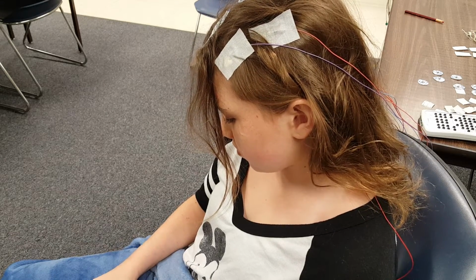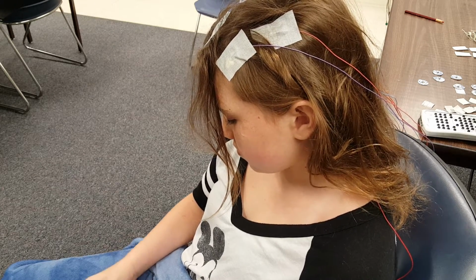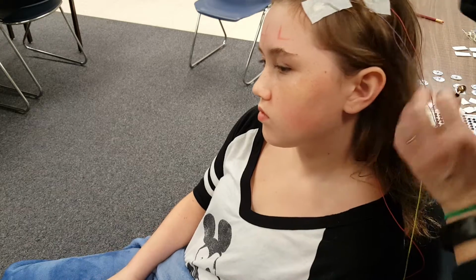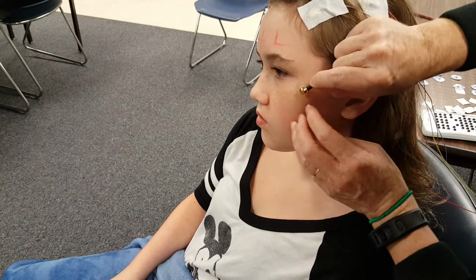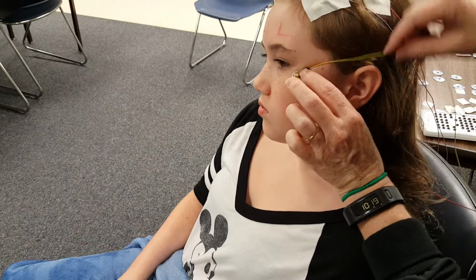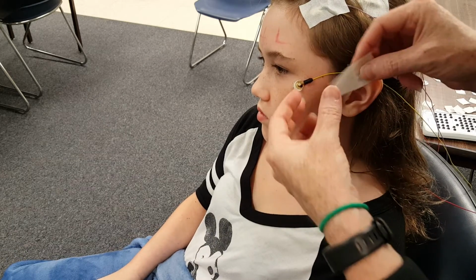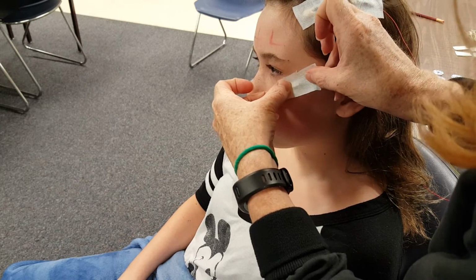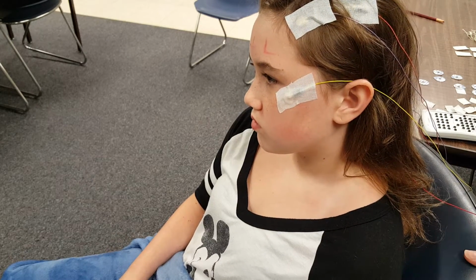Next we'll do the left eye. I wouldn't maybe move my patient's head quite like I'm moving my daughter's, but in this eye one I always tuck over the ear. Again, with your cover roll or your gauze, you want to be careful not to poke your patient in the eye. Seems obvious, but it's easy to do when you're focused on a task. So, there you go.